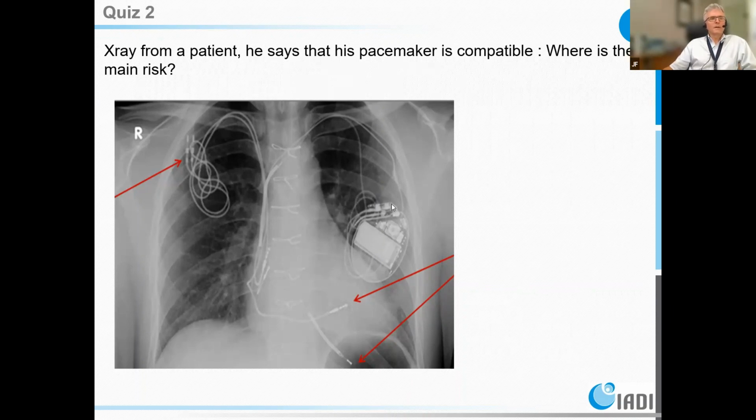This will be an antenna, and all the power will go on the wire here, and this will heat here. You mentioned also interference from B0. This is a little ferromagnetic material here. So the B0 field will change due to this, and this is not good for images. So you have a hole in the system, a black hole in the image.